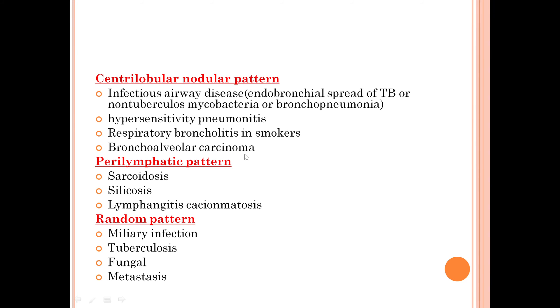In a perilymphatic pattern, nodules are distributed along the subpleural regions, fissures, and lymphatic routes — the diagnosis could be sarcoidosis, silicosis, coal workers' pneumoconiosis, or lymphangitic carcinomatosis. In random distribution, nodules can be seen anywhere, and the first diagnoses that come to mind are miliary infection such as tuberculosis or fungal infection, and metastasis — particularly from thyroid carcinoma, renal cell carcinoma, melanoma, choriocarcinoma, and breast carcinoma.